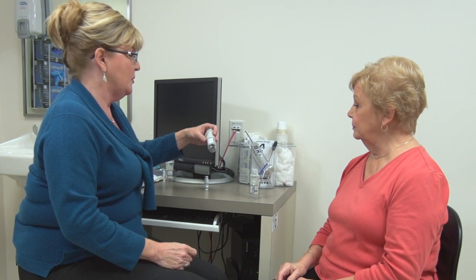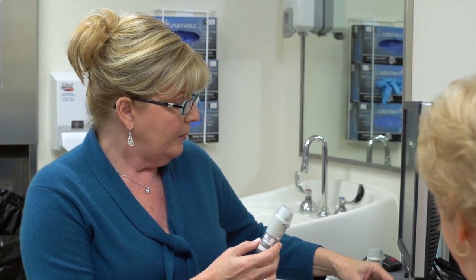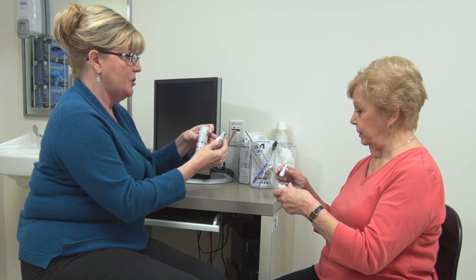Mary introduces herself to Mrs. Ryan and explains that she is there to show her how to use a new medication delivery device called the Respimat. She notes that it comes in two different pieces: the delivery device and the medication container.